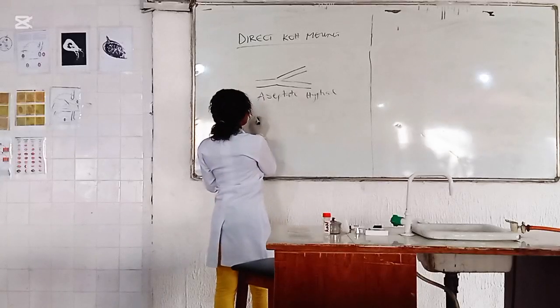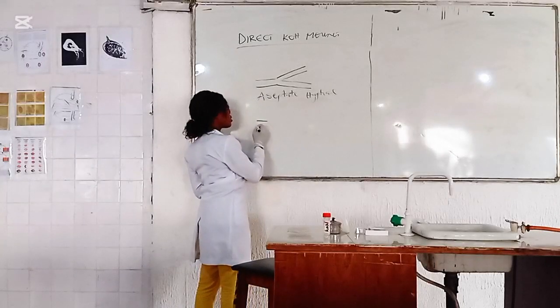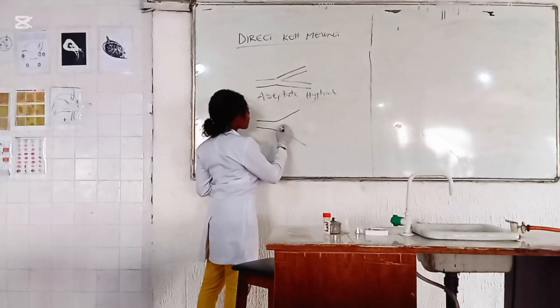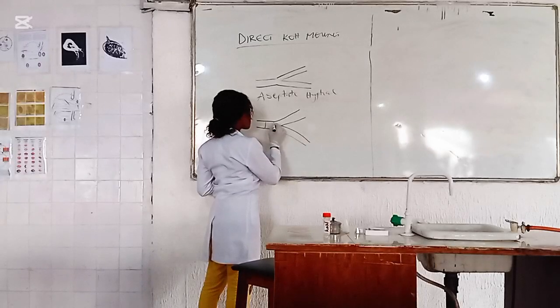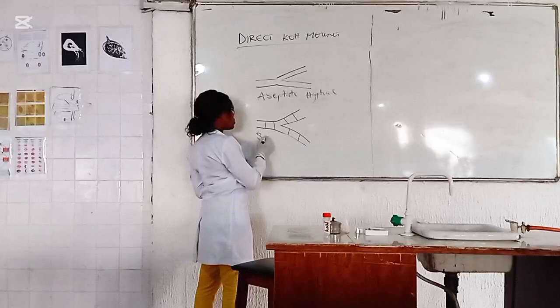Now, if it looks like this, this is septate.